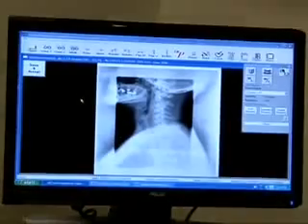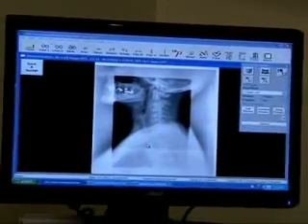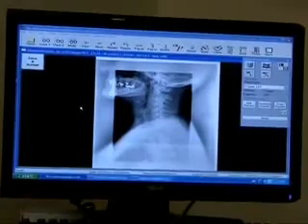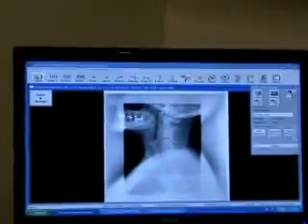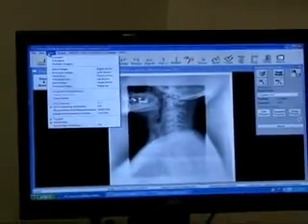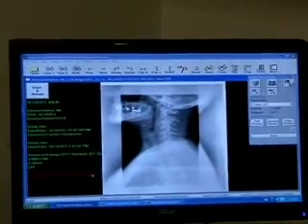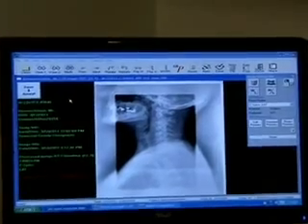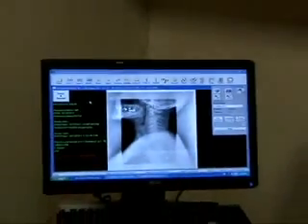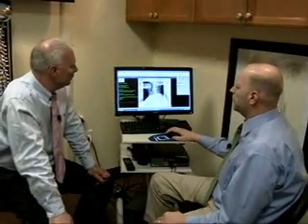So we would click on the image, and we have our x-ray. Now at this point, it'll tell us by looking at some aspects of this whether we were underexposed or overexposed, and we can look at it in this manner. If we look at the patient information overlay, we could be underexposed here, or overexposed, and it tells us, but it really doesn't matter. It just gives us a good buffer to tell us what images to take for certain body types, because after we're done with this, now we can manipulate the image.